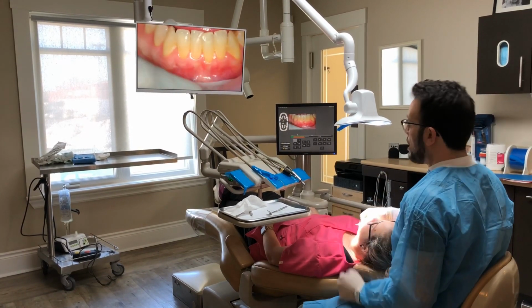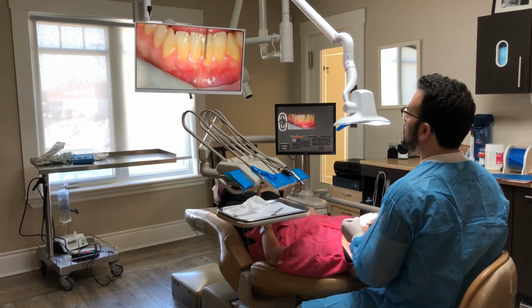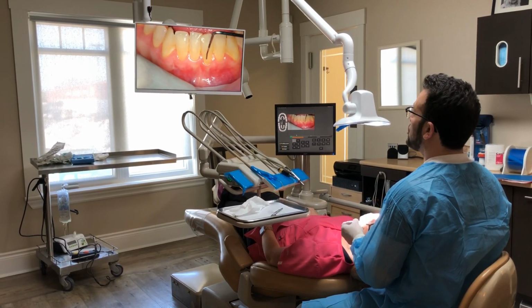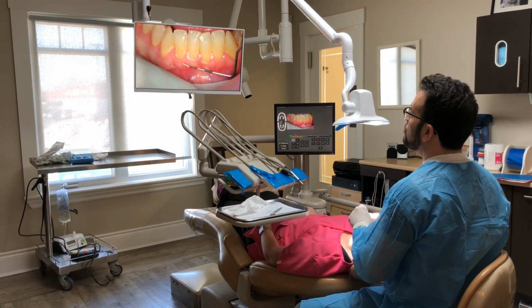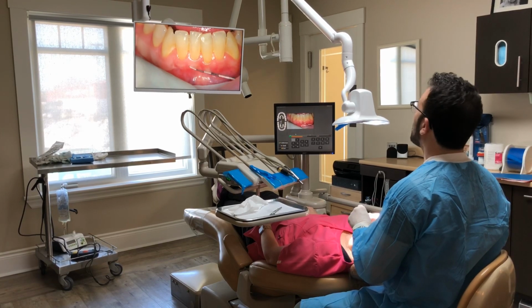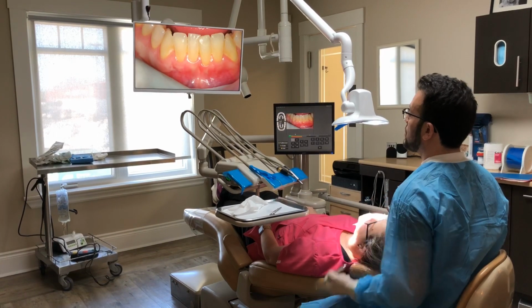self-autofocus function. If I want to record, for example, to show this issue where there's a recession and lack of attached gingiva, I can hit the record button and I can record a video showing the patient the problematic area. So instead of just showing her a photo, I can take a 5-second video in the imaging software and discuss it with the patient.